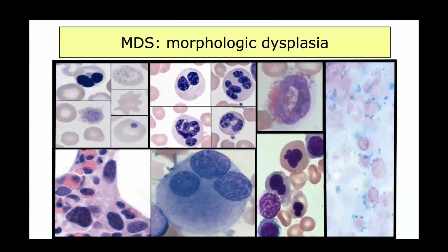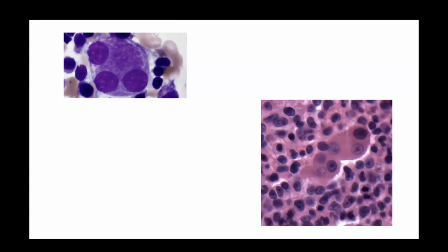As we look around, we can find more morphologic abnormalities that typify a myelodysplasia. In the peripheral blood smear amongst the red cells in the top left are included things such as basophilic stippling, acanthocytes, even Howell-Jolly bodies, and giant platelets can be seen, a variety of different neutrophil abnormalities in the center top, a ringed eosinophil towards the top right, ringed sideroblasts on a bone marrow iron stain, and an abundance of dyserythropoiesis and dysmegakaryopoiesis evident in the bone marrow aspirate and indeed also in the bone marrow biopsy on the bottom left.